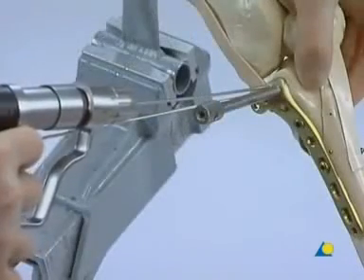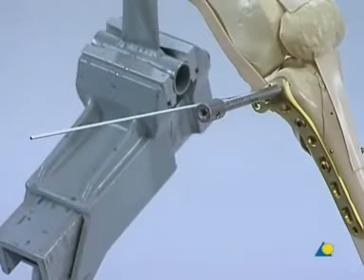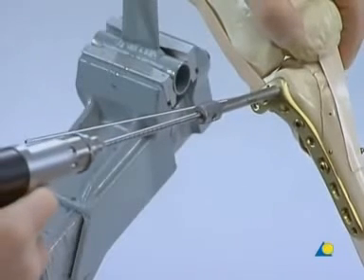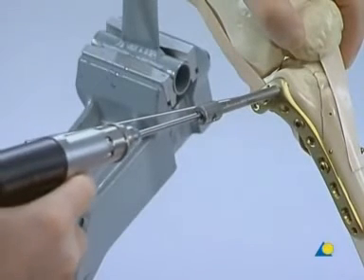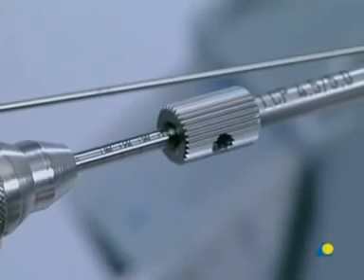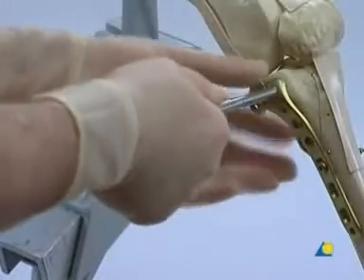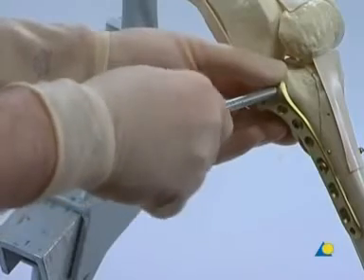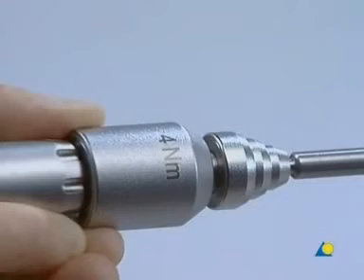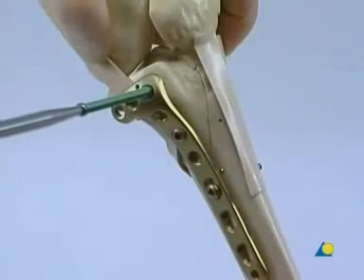The anterior K-wire is removed to avoid collision with the drill used for the anterior hole of the proximal end of the plate. A hole is drilled using the 4.3 millimeter drill bit. The screw length can be taken from the markings on the drill shaft. The drill sleeve is removed. The 4 Newton-meter torque limiter is used to insert a 5.0 locking head screw of the appropriate length.